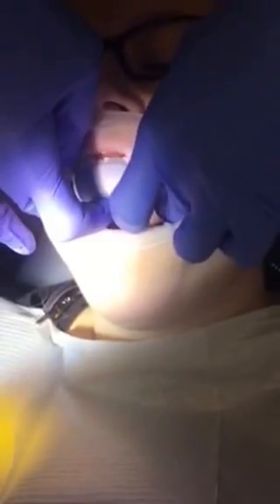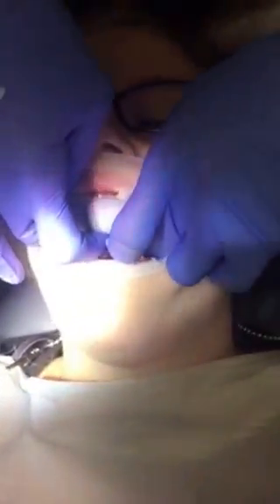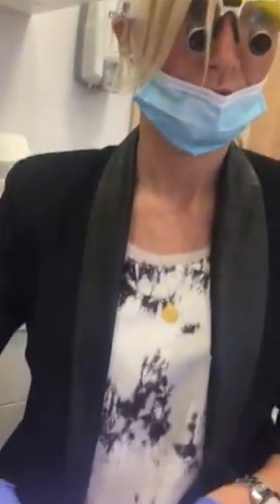You see it kind of squirts out there — we want a little bit of extra up here. That way we can peel this off and it'll be a much cleaner peel when we're done. So it is good to have excess. It's pretty good on the palette actually — see, you can see it.